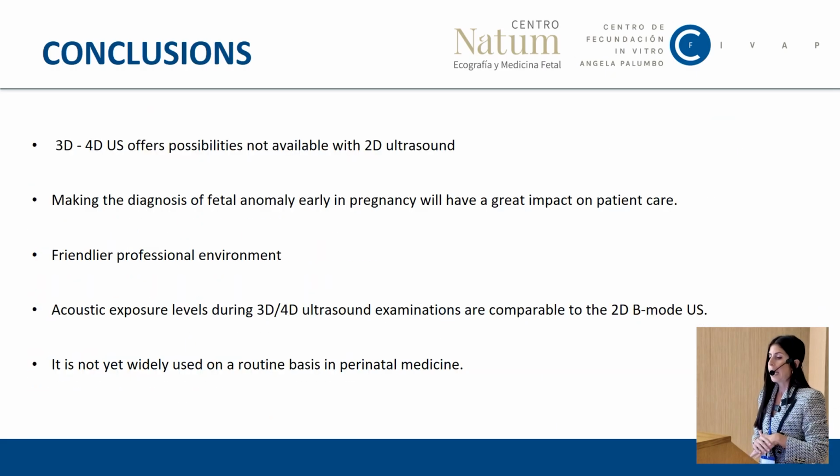So, to conclude, 3D and 4D ultrasound offers possibilities not available with 2D ultrasound. Making the diagnosis of fetal anomaly early in pregnancy will have a great impact on patient care. It also gives a friendlier professional environment. We know as well that acoustic exposure levels during 3D and 4D ultrasound examinations are comparable to 2D B-mode ultrasound, and unfortunately it is not yet widely used on a routine basis in perinatal medicine. It's just an additional tool, but cannot replace the 2D ultrasound.